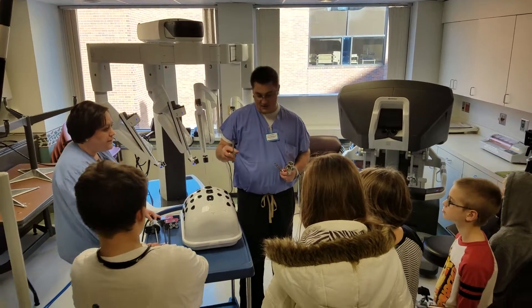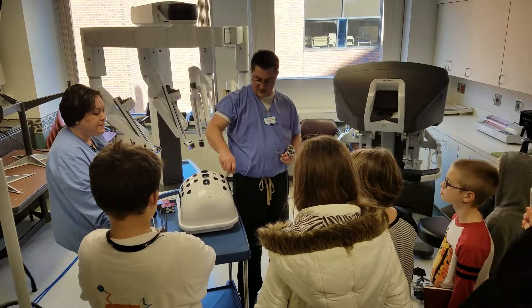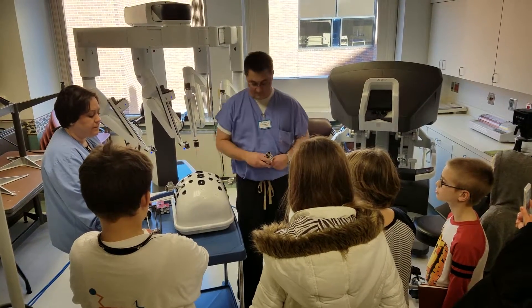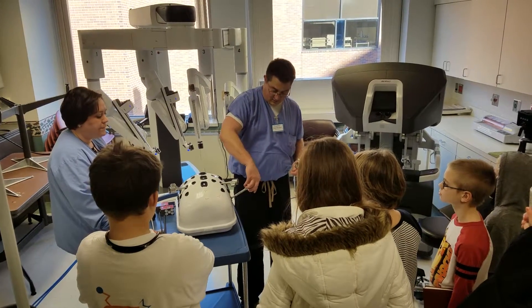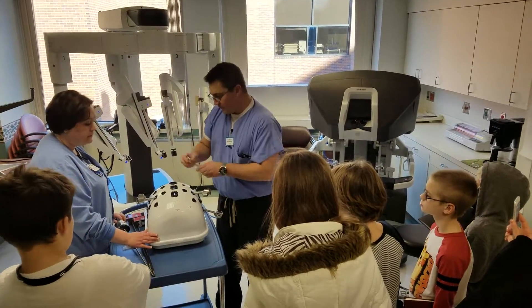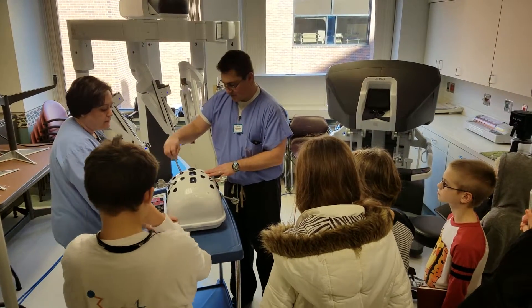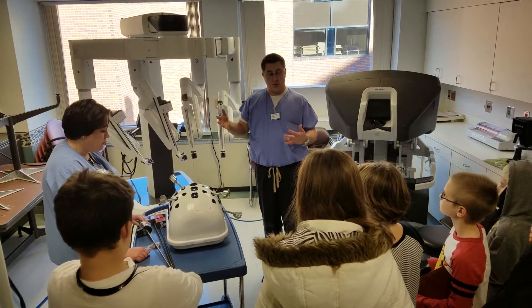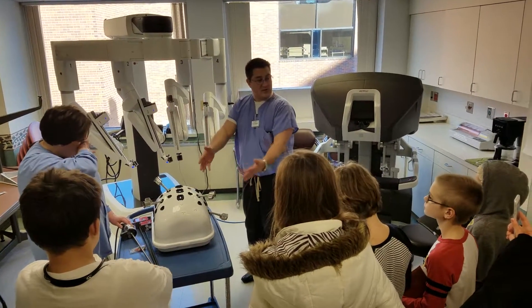So what the doctors do is they place these ports — they make little incisions and they place these in your tummy. Depending on what they're going to do, what organ they're going to work on, et cetera, and they do something like this. Once you do that, you're ready to connect the robot to the patient.